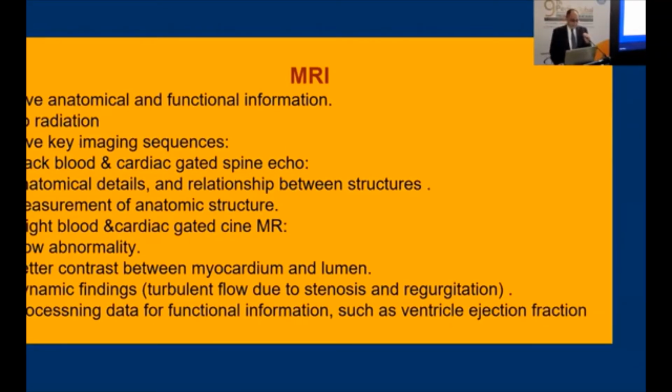So it can give us a good idea about flow abnormality and a better contrast between the myocardium and the lumen of the cardiac chamber, and also dynamic information about turbulent flow, stenosis and regurgitation.